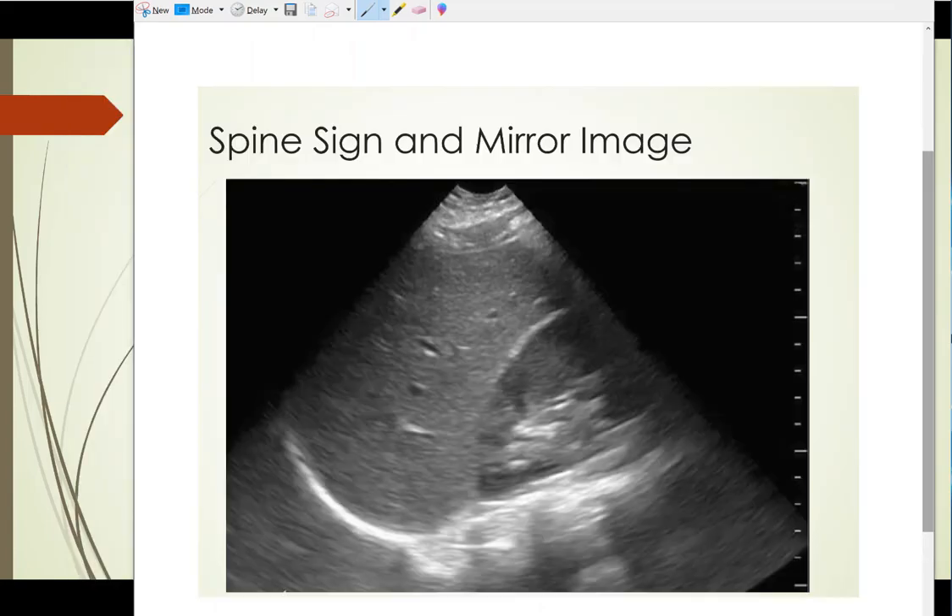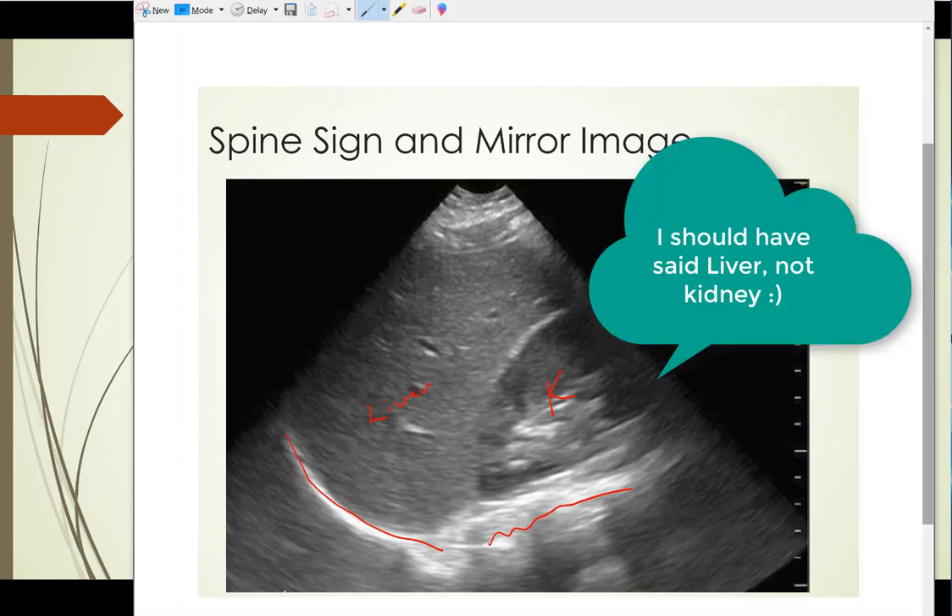Here is what appears to be a normal right upper quadrant view. I want to talk about the spine sign and mirror image. You need to go superior enough during this FAST exam to rule out a pleural effusion as well. A mirror image is normal — this is the liver, this is the diaphragm, and this looks like liver but it's called a mirror image. The ultrasound doesn't find any fluid or bone, so it just reverberates and creates a mirror image of the liver. This is the spine, and this is the kidney. That mirror image is a normal finding because the lung is full of air, and you just get the mirror image bounced back.